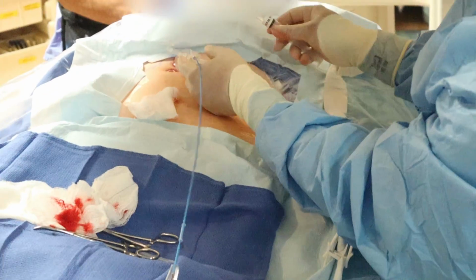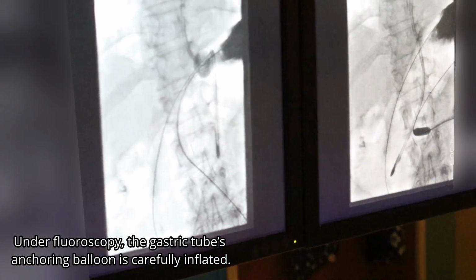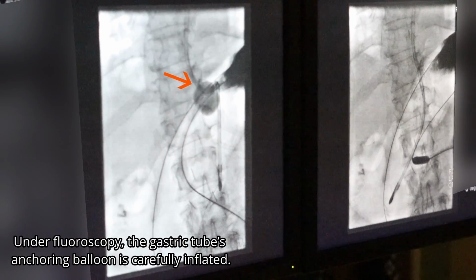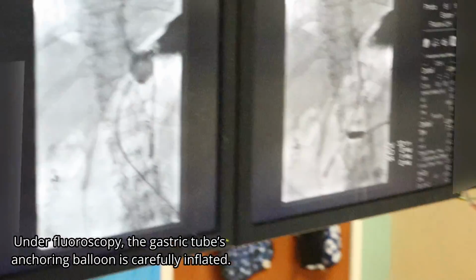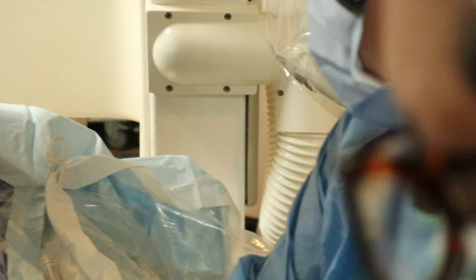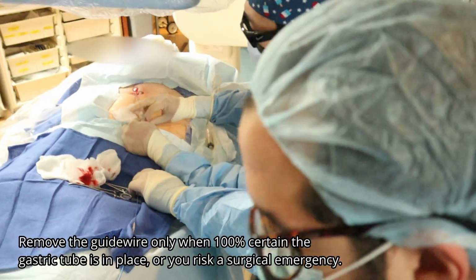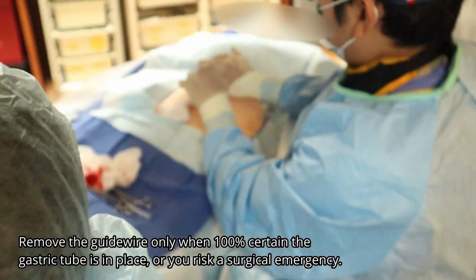A bit of sterile water mixed with a very dilute amount of contrast. I'm going to insufflate this cup. Very dilute amount of contrast. We're going to pull this thing over the wire first, up against the stomach. We're going to keep the wire in until we're certain that we're in the stomach here.